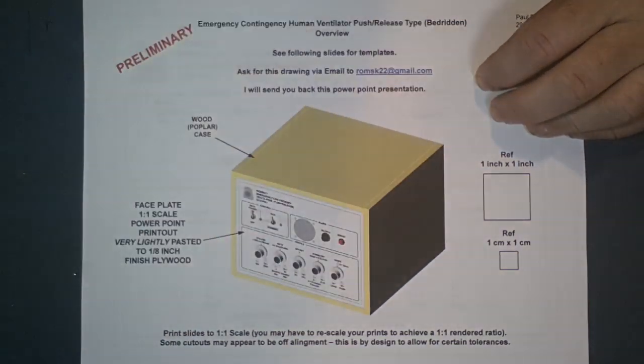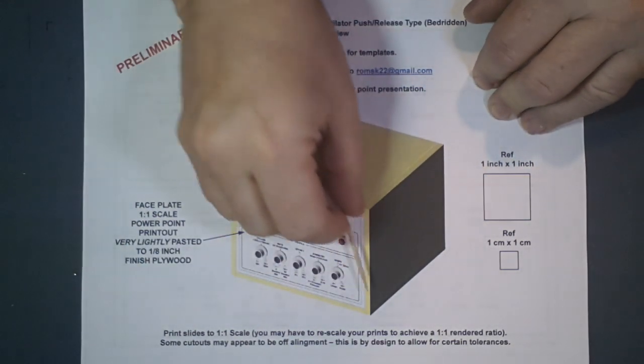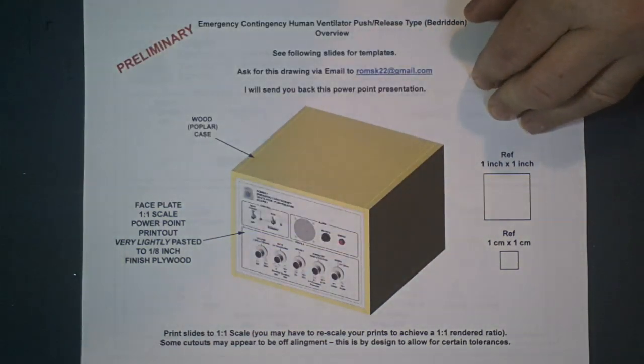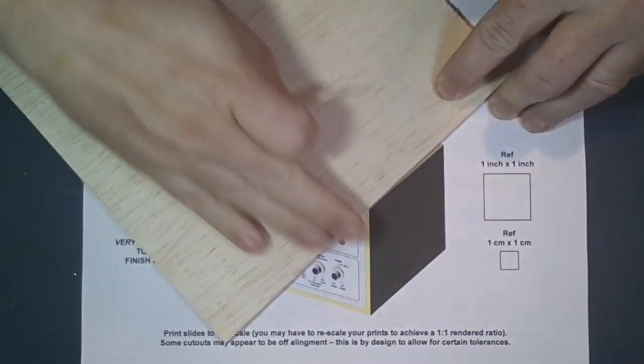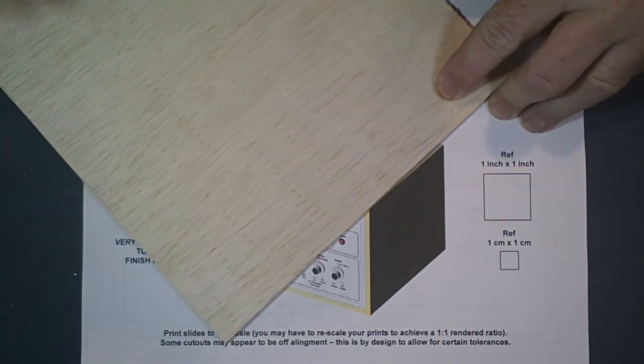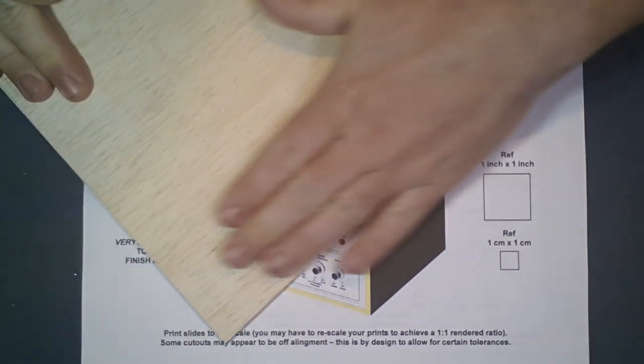And there's a whole technique to this. You're just gonna paste it down. You have to apply a very, very light coat of wood glue to the plywood, and then paste the wood down and smooth it out. And you only have a few seconds, and you have to put a lot of weight on it to keep it from bubbling. If you don't, it's going to bubble and look like crap.